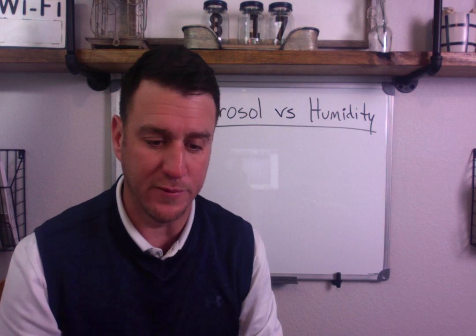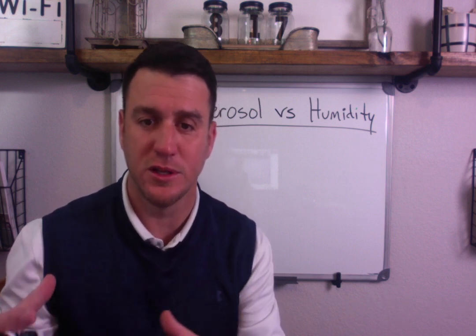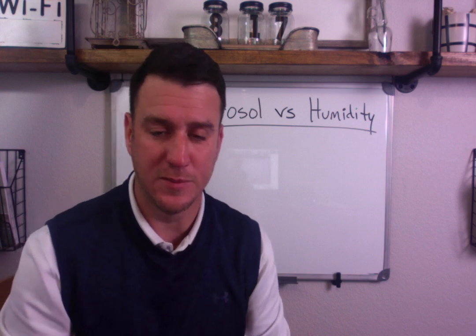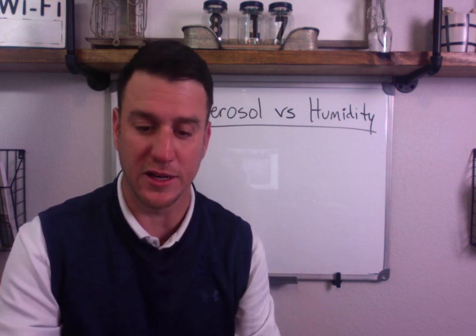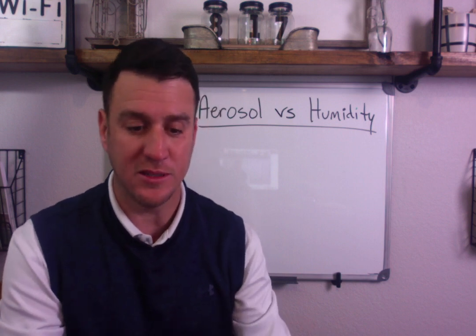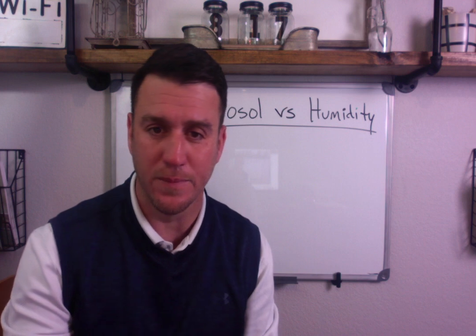Comes from a viewer named Tay who wants to talk about aerosol versus humidity and specific questions about things like the vibrating mesh, the ultrasonic neb, the wick, HMEs, humidifiers, things like that. So we're going to break this down for you.